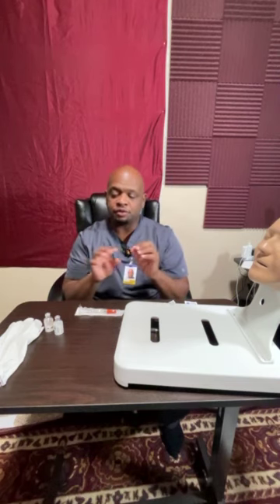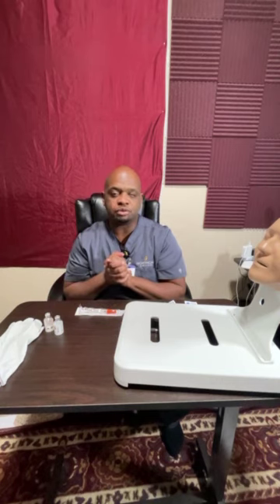It's going to be the right patient, the right medication, the right dose, the right route, the right time, and the right documentation. The route for this type of medication is going to be subcutaneous injection of insulin. So those checks are done.